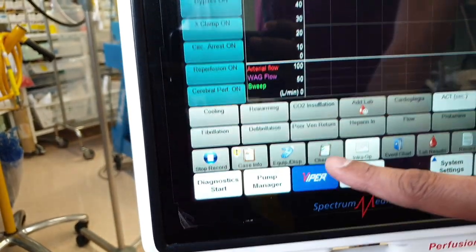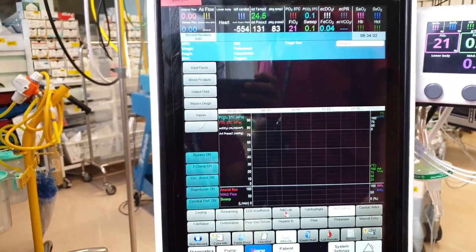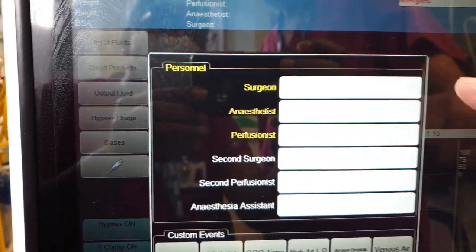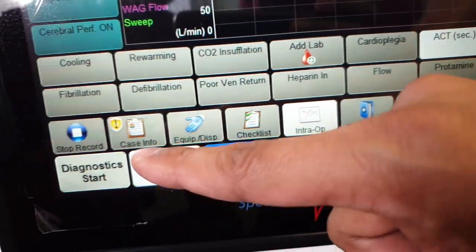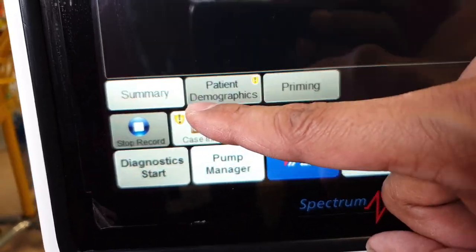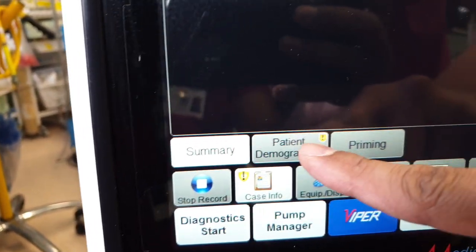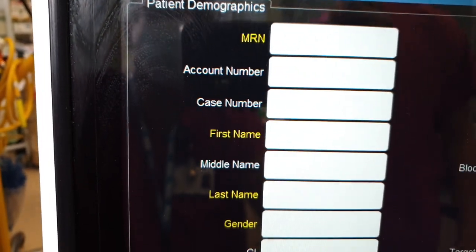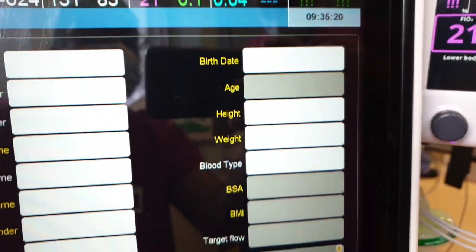Now, this screen will appear. It's a new screen. After that, go to the toolbox, and there you put the surgeon, the anesthetist, and the perfusionist. Go to the case info. There you will find the demographics, and there you put the patient's details. So you put all the patient details in. Now I will do it.